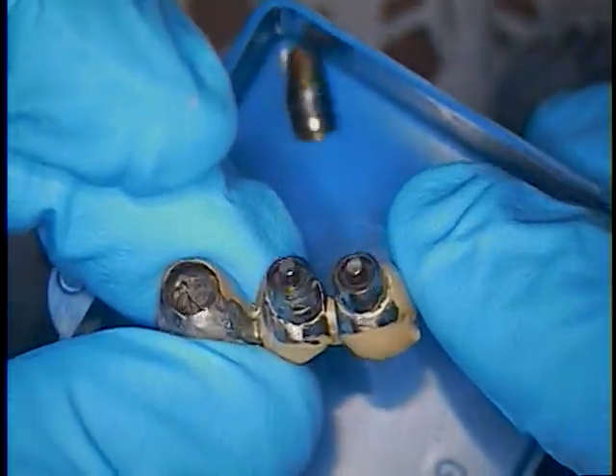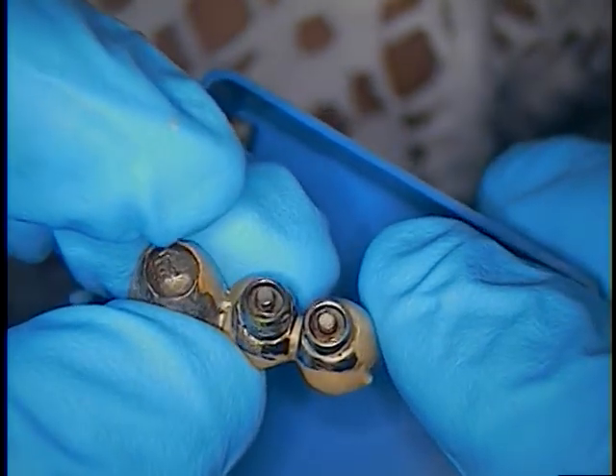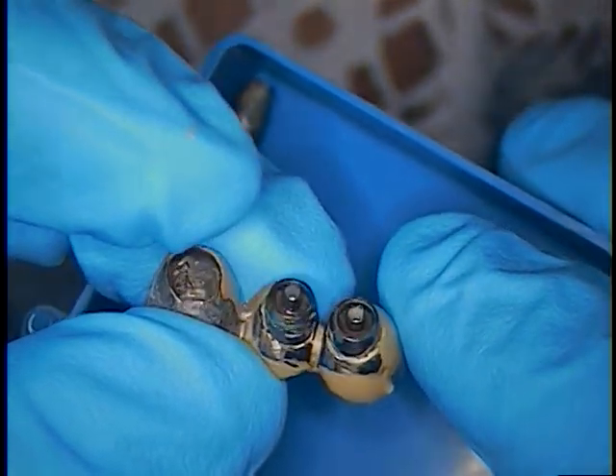Just to show you what the prosthetic scheme looks like here, we have the parts at hand. The patient was nice enough to bring those with her today, so now we have it. This is the old bridge. These look like stock abutments that were prepped directly in the mouth, and then of course the case was cemented into place, so all three of them have fractured.